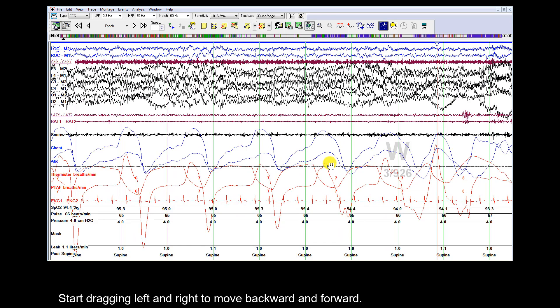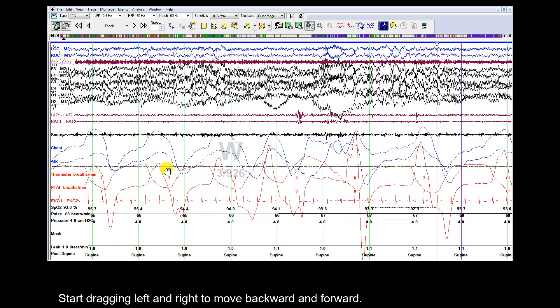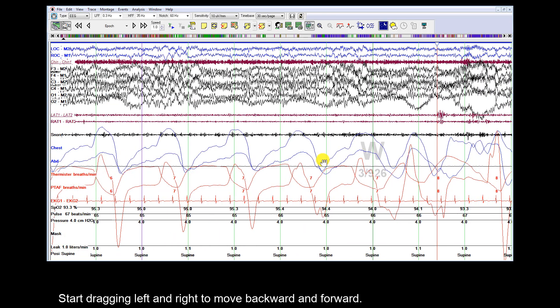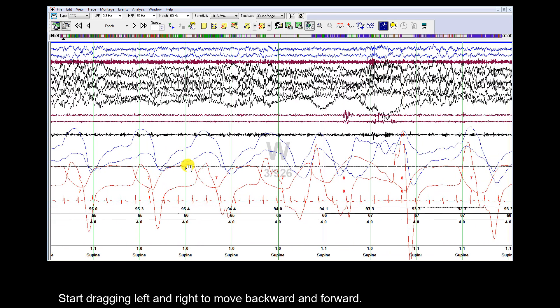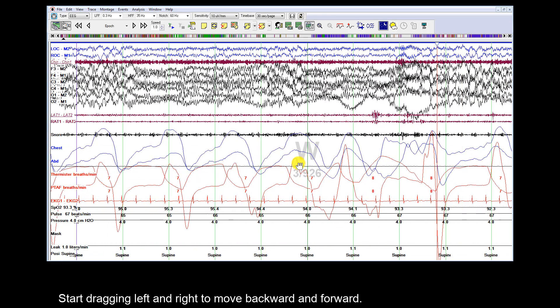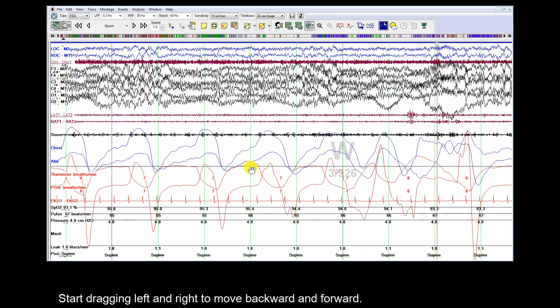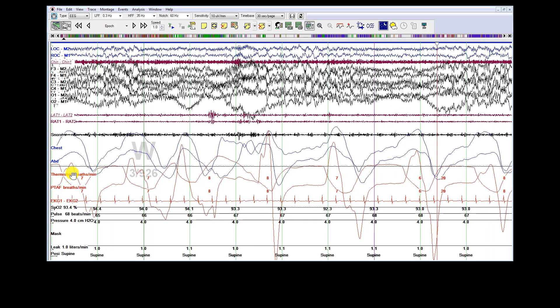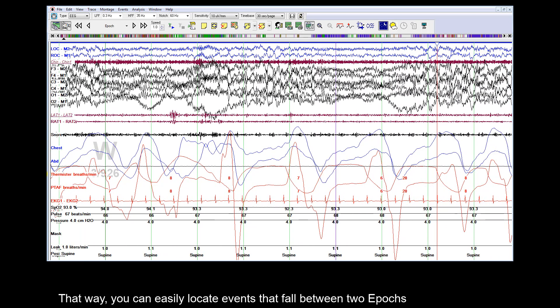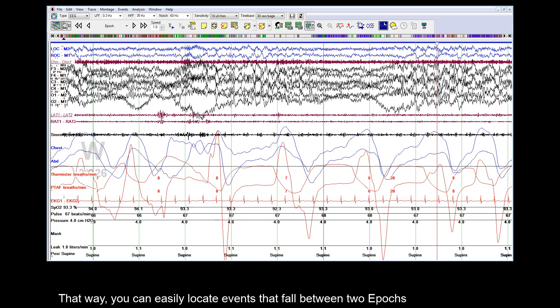Start dragging left and right to move backward and forward. That way, you can easily locate events that fall between two Epochs.